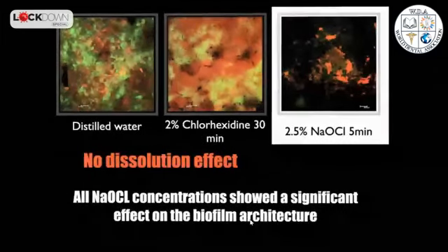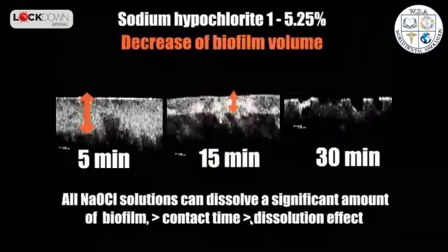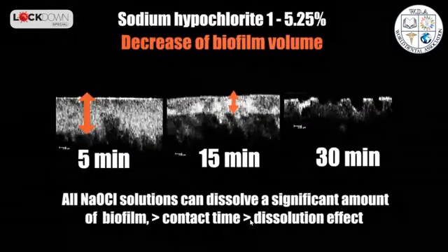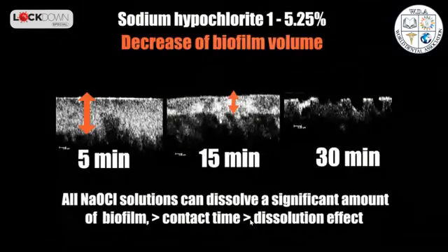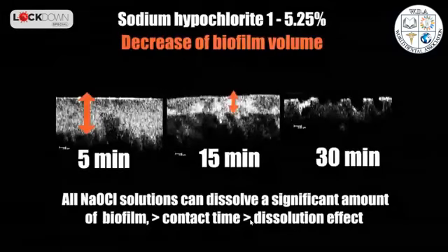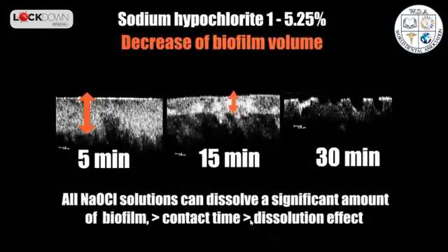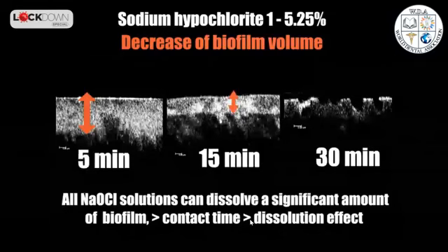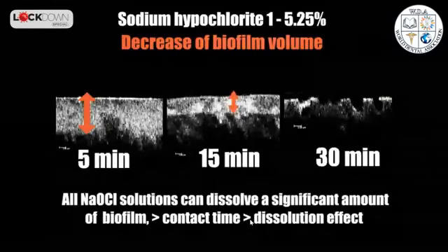And in the same experiment, we saw the influence of time. And sodium hypochlorite, as you know, is a very reactive chemical compound. It's very interesting because even if you use low concentrations of sodium hypochlorite, you can compensate the lack of tissue dissolution by increasing the time. You can see we are observing like a sagittal section of the biofilm.